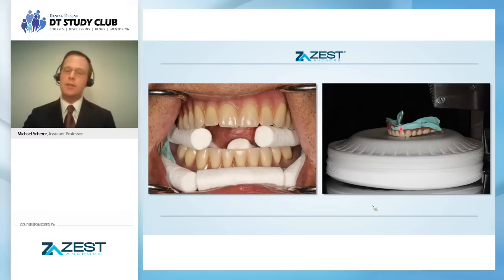Now in this picture, I do like to reorient the denture while it is in the CBCT scanner. If I'm doing a mandibular denture, I want the tissue side down. However, with some of the more popular implant suites, it is very easy to just rotate around, so it's not that critical.